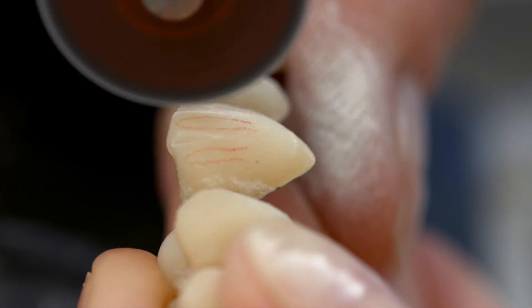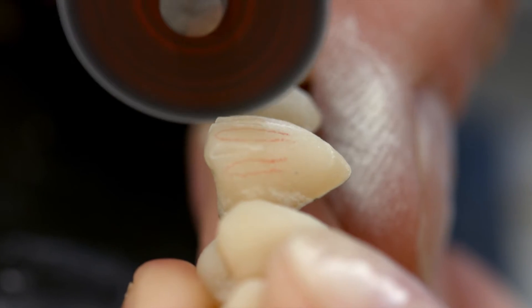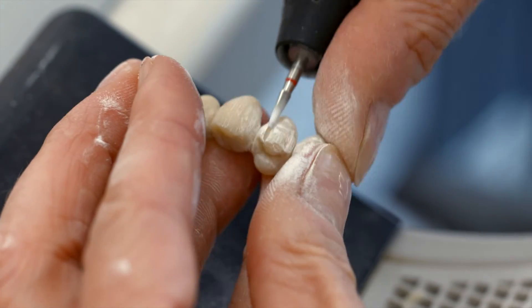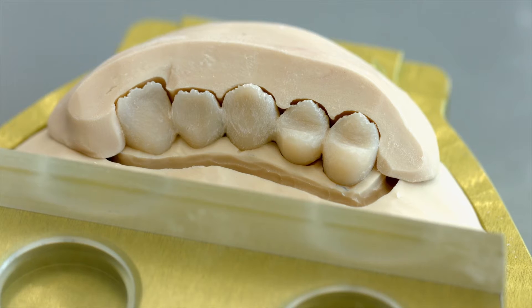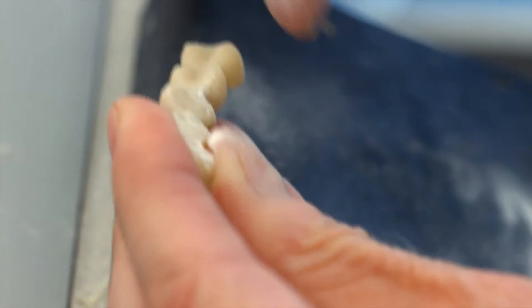You may draw the anticipated incisal structure on the dentin material using color pencils. Check the cutback with the help of the matrix. Cut back the dentin material until you reach the desired contour.